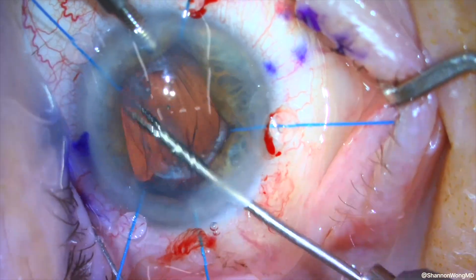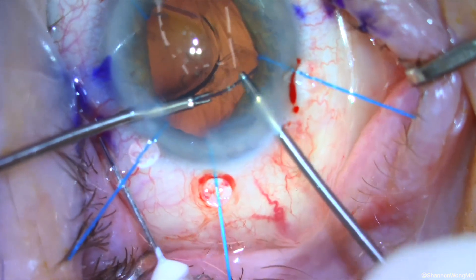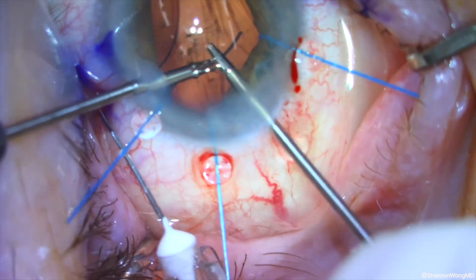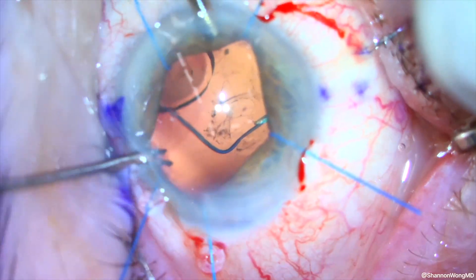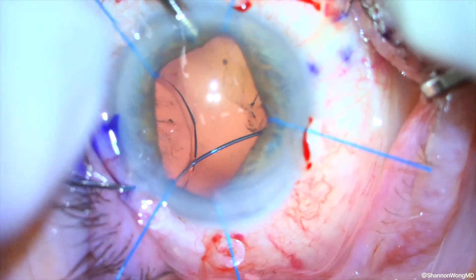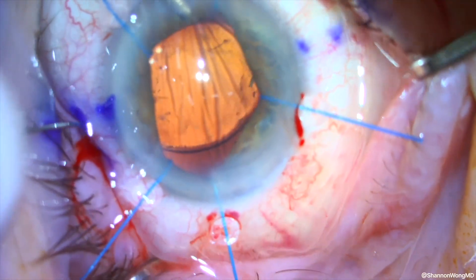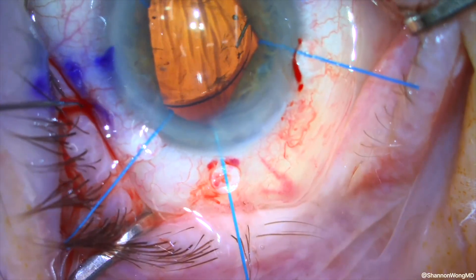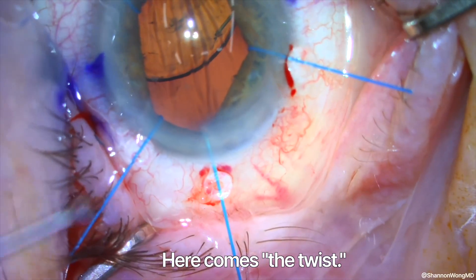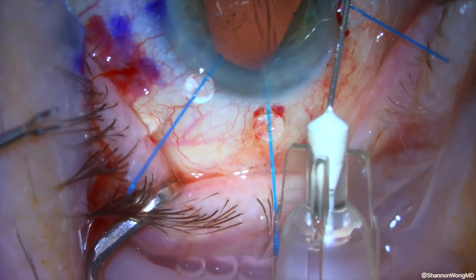We can see the capsular bag complex now and choose to remove it using our micro forceps. Using two micro forceps in a hand-over-hand maneuver, we position and grasp the trailing haptic with Utrata forceps to feed this trailing haptic into our second 30-gauge needle. As we withdraw the right haptic from the sclera, we withdraw the left haptic concurrently. The left haptic can be seen exteriorized first, so we let go of the right haptic, which is within our 30-gauge cannula, and focus our attention to the left haptic, grasping it with the Utrata forceps.